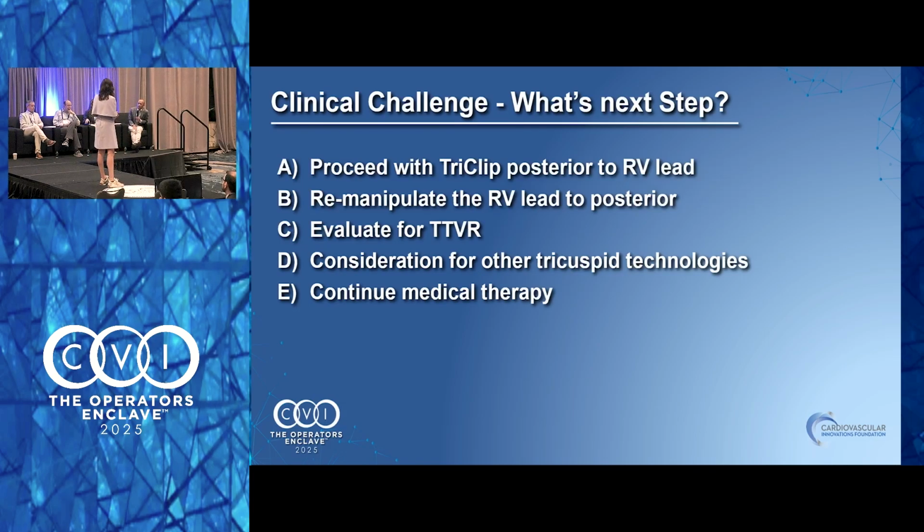Nadira, what kind of lead is it? Do you know how long it's been in there? So pacemaker has been in there for at least more than 5 years. Okay, so chronic lead, and it's a pacemaker lead, not an ICD lead? No. Okay, so chronic lead, not an ICD lead. Manny, what do you guys do at Piedmont? Extract, not extract? How do your EP colleagues feel about this?